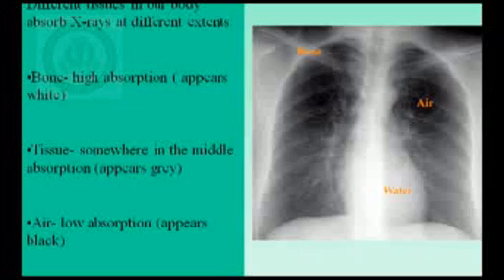When you have a chest X-ray, the X-ray beam penetrates in a direction that is mentioned, that is normally in a PA view. Now, there are certain structures which appear as white. That means those structures have a very high absorption of X-rays. Certain structures will appear as of intermediate density or grayish in appearance, that of water containing structures and tissues, for example, the liver area as well as the heart. Now, certain areas which contain air will appear as black because they do not absorb any X-ray.